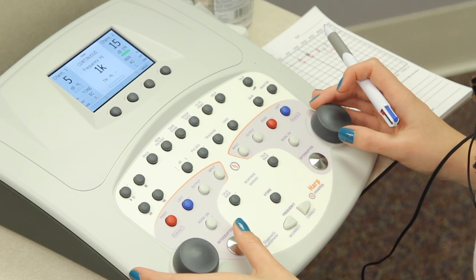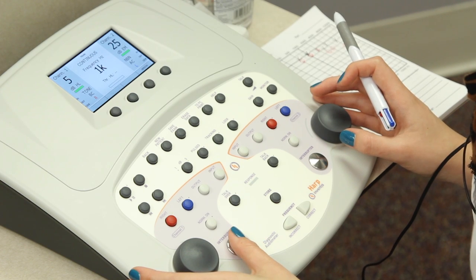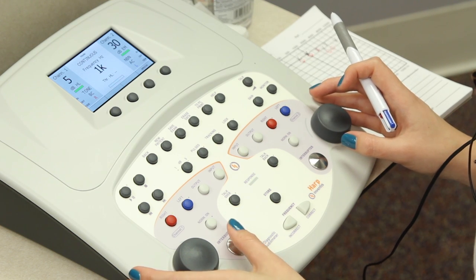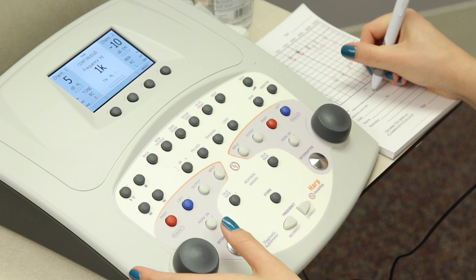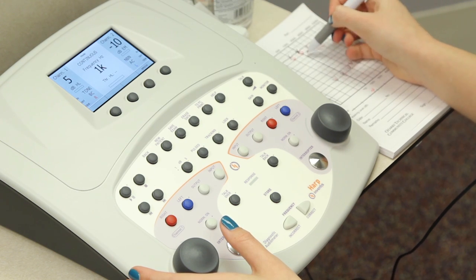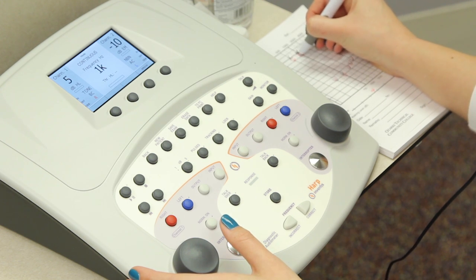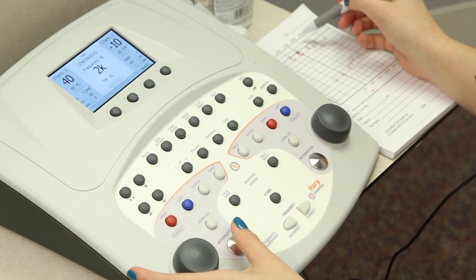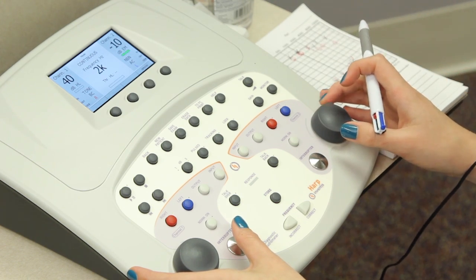So he hears that, so we're going to increase by 5 — and he responded. Now we're going to move on to 2,000. At 2,000, his left air conduction threshold is 5, so we're just going to add 10 and start the masking at 15 decibels.